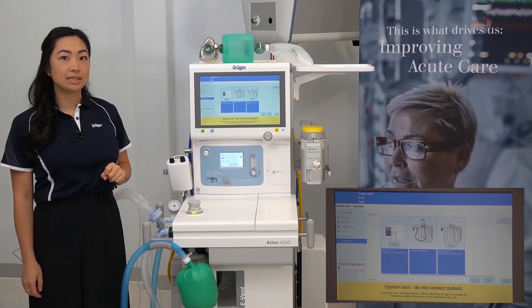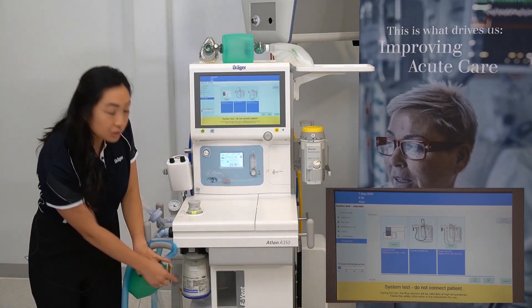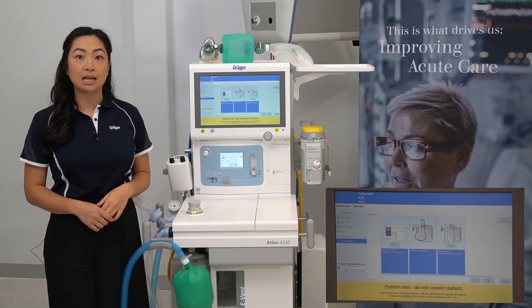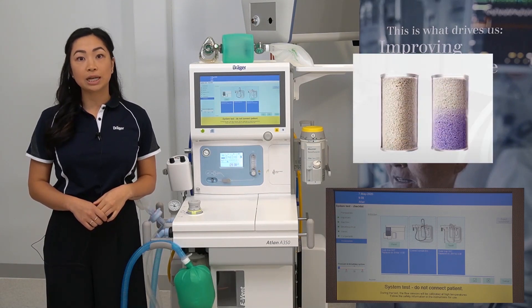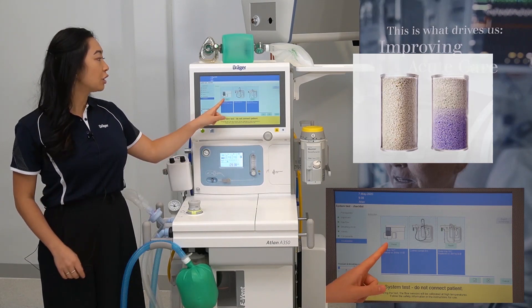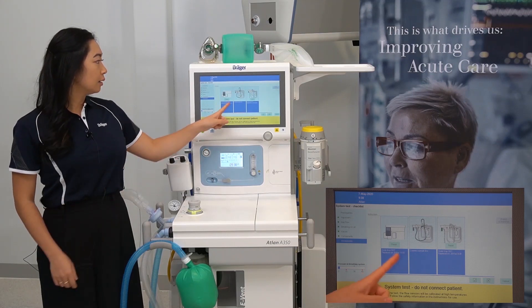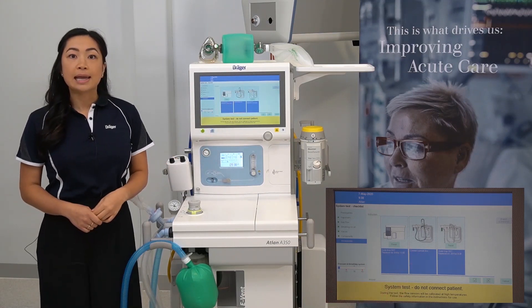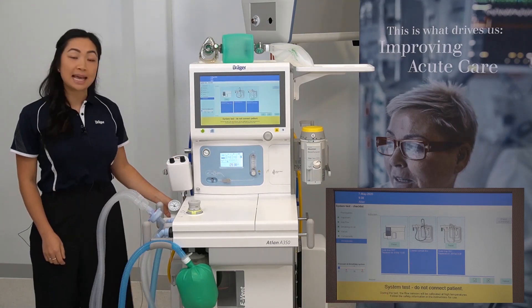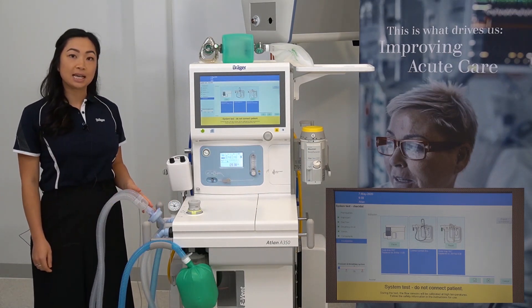Now we're up to the accessories. To check that your soda lime is okay, visually inspect it for any significant discolouration — soda lime will change from white to purple when exhausted. At this point you can reset the date and time stamp if you exchange a soda lime. Connect your sample line, ensuring one end is connected to the water trap and the other end to the machine side of the filter.